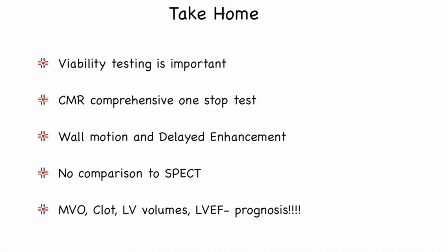So, the take-home messages are: viability testing is extremely important in today's practice and helps in guiding correct clinical decisions with regards to revascularization or optimal medical therapy. Cardiac MRI is a comprehensive one-stop test which gives us all the information required to take the right decisions in management of patients.